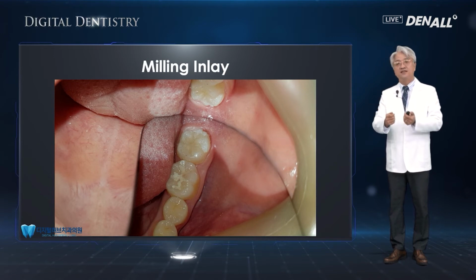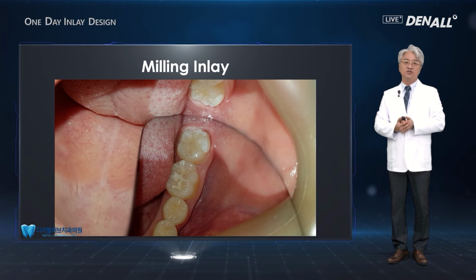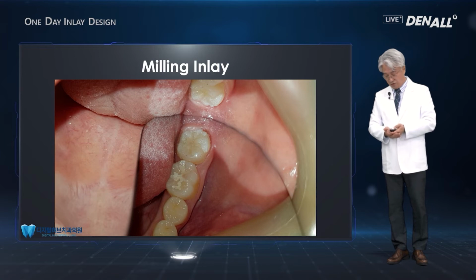And even if it's not the best fit, or if there's a dead space, then with the resin cement, it can be covered. And clinically, the CAD-CAM inlay advantage is that it can give you much better results.